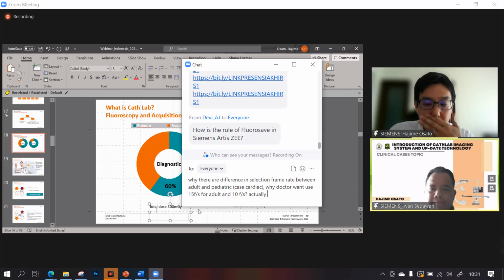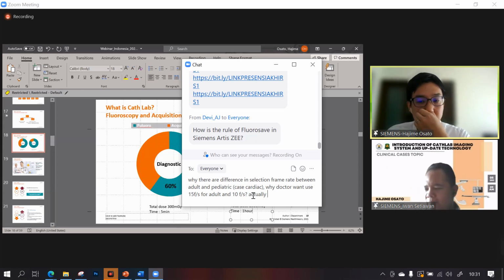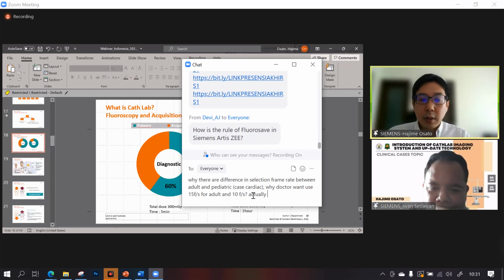But in terms of the procedure time, this is only 5 minutes, for example. Oh, I see. Yeah. The time for the other one is an hour, for example. So that's why it's totally different. I mean, the total value.